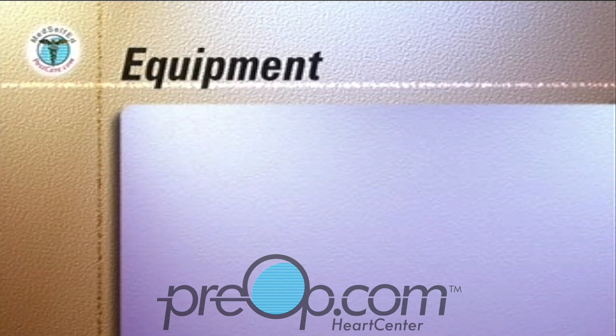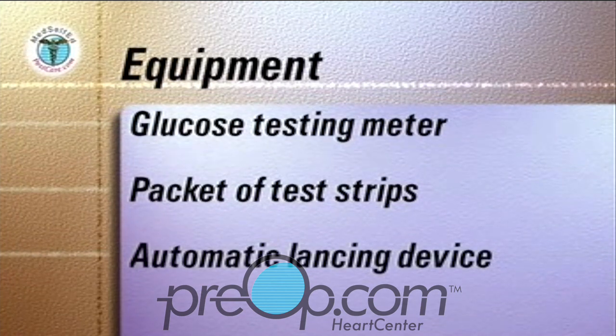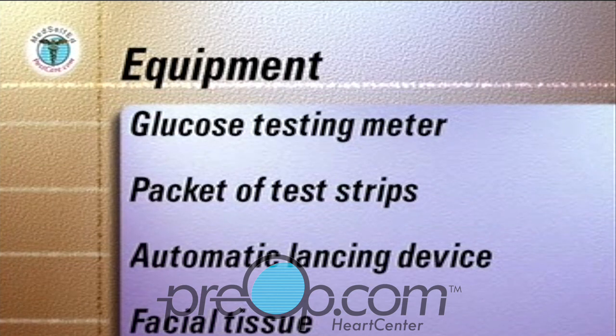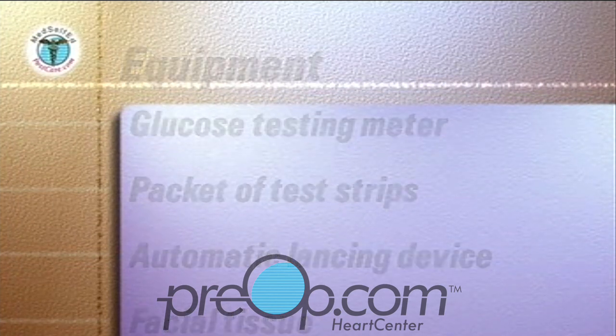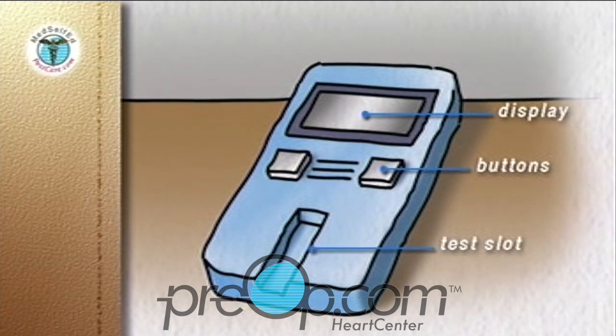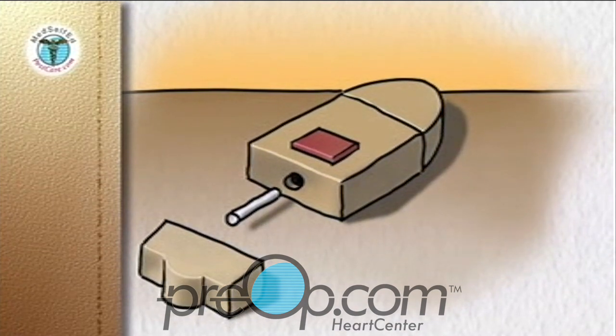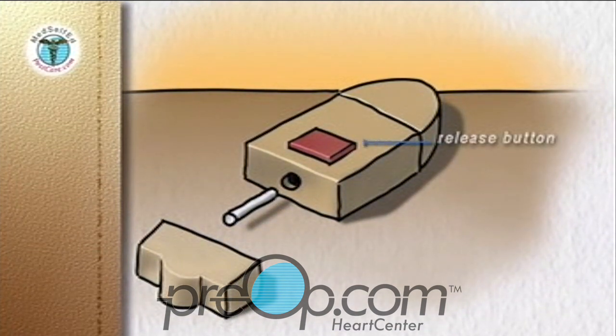The equipment you will need to assemble includes the glucose testing meter, a packet of test strips, an automatic lancing device, and facial tissue. The meter will have a display with blood sugar readings as shown, an on-off power button, and a slot into which the test strips are inserted. In the back of the meter will be a compartment for batteries. The automatic lancing device has 3 components: the body with a release button, lancet holder, and cocking device, the removable end cap, and a separate short lancet.